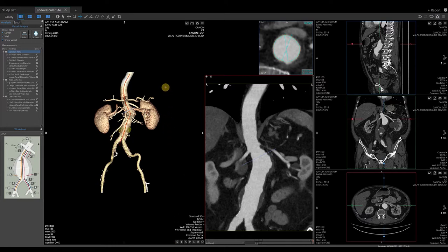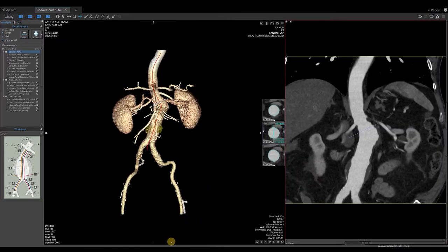Explode your 3D image viewport to full screen with a double left click or by selecting the one-up button in the upper corner of the 3D image. To fit our curved planar reformat image to the window, select the button that looks like a small lightning bolt in the upper left of the CPR image.